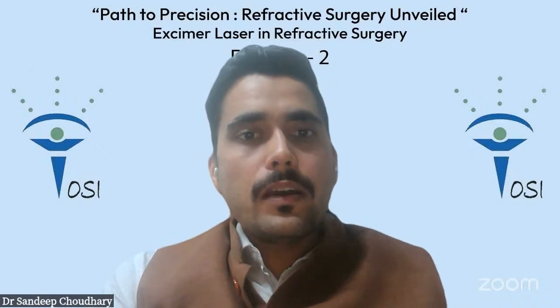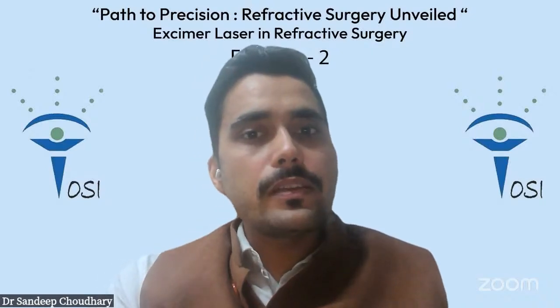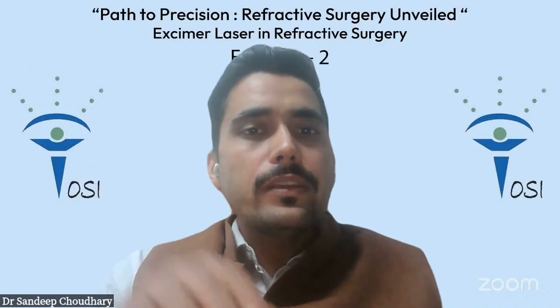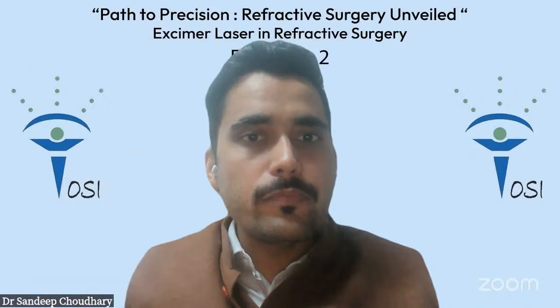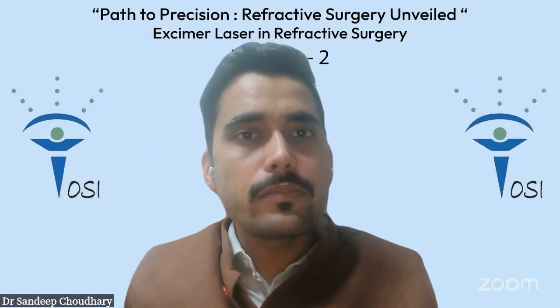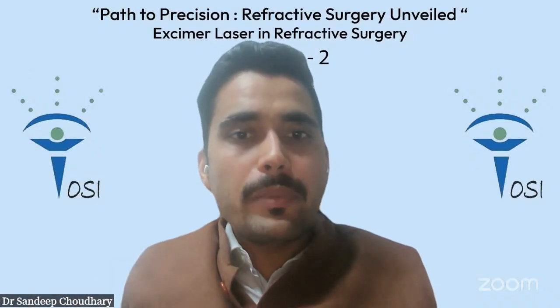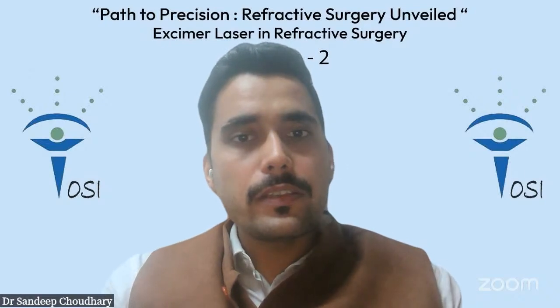So I believe in going ahead with a two-step procedure rather than epithelium removal with the laser itself, because in the peripheries the epithelium also gets thickened, so the ablation would be lesser than intended. That is what I think.